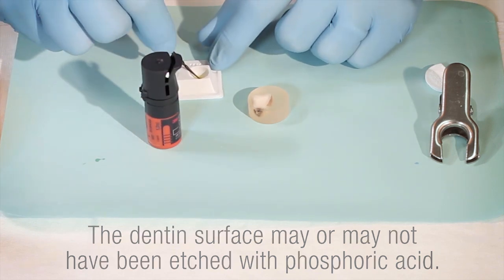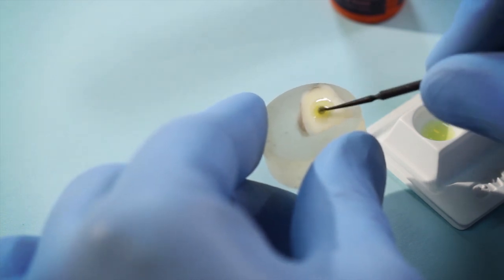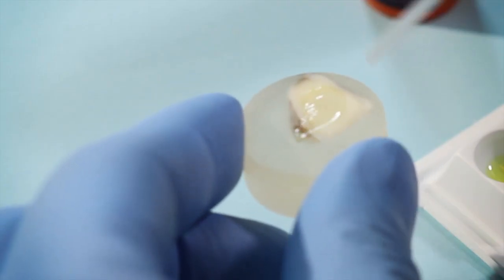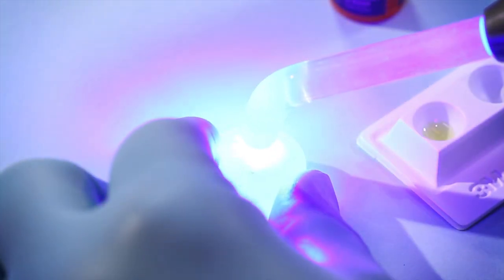Scotch Bond Universal Adhesive was applied with a brush using a scrubbing motion for 20 seconds to assure uniform distribution across the surface and penetration down into the dentin. It was gently air-dried for 5 seconds to evaporate the solvents and produce a uniform film, then light-cured for 10 seconds.